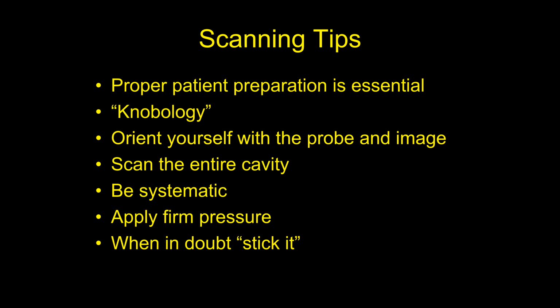And again, ultrasound doesn't tell you what it is. It's not specific. It doesn't tell you if it's benign or malignant. So for the most part, if you see something abnormal, don't be afraid to stick it. Put a needle in it, look at those cells under the microscope, do an aspirate, do a biopsy. Don't be afraid to stick it.